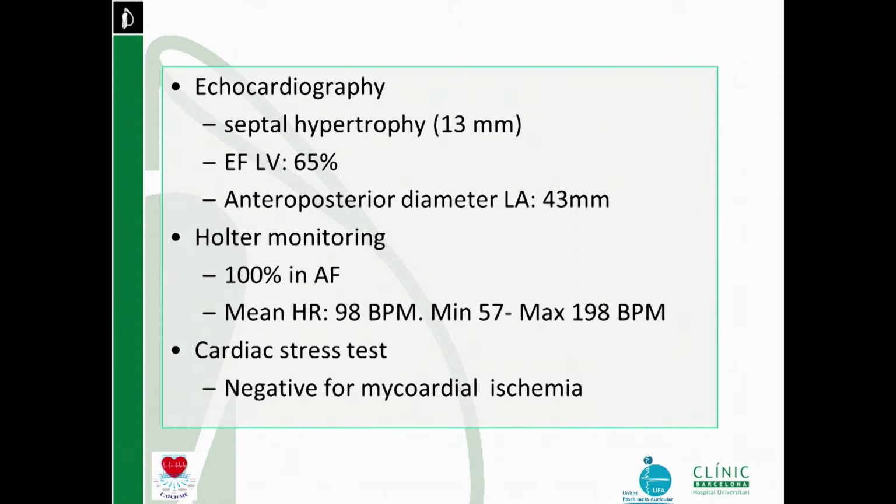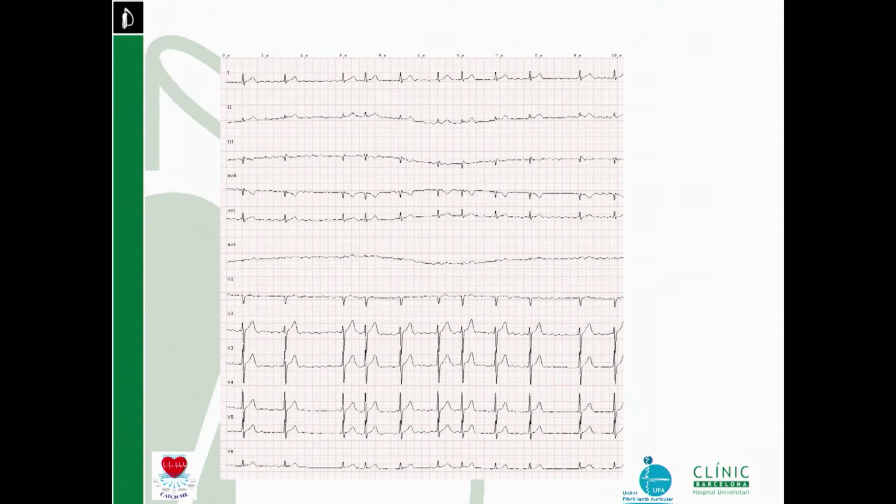There's a small septal hypertrophy. But, well, this is especially for Yuri, because he's analyzing the electrocardiogram, and you see the electrocardiogram has very low voltages. This is an indication that the atrium is sicker than it should be, probably, for the clinical history of this patient.